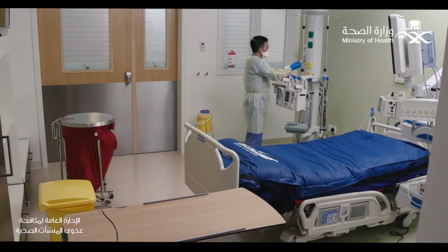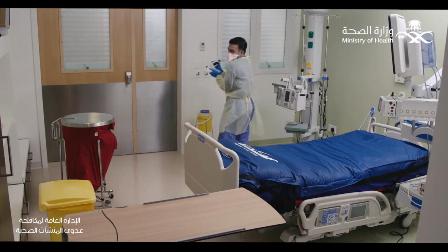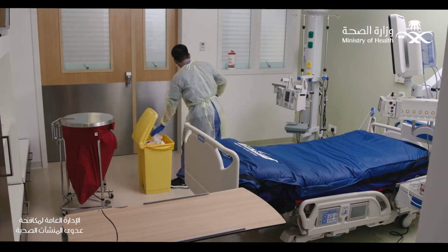And he begins to conduct a thorough survey and disinfection of the environmental surfaces of the devices in the room, as all surfaces are cleaned and disinfected at the end of the procedure.